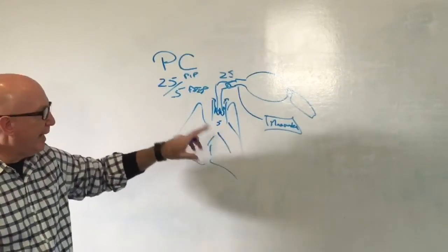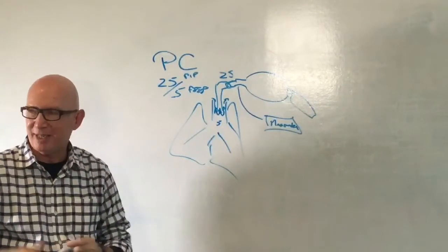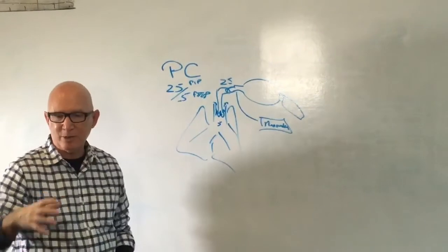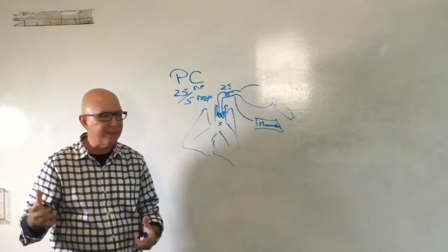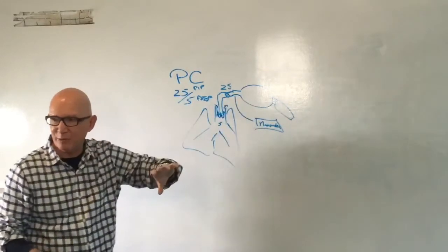And the reasoning behind that is because when we're squeezing a bag, we can make subtle changes with the strength that we squeeze the bag with that a ventilator can't do. And those subtle changes will help to stabilize this pressure and get the chest to actually rise. So there is a difference in that regard when it comes to whether it's the ventilator or the bag that's actually generating those pressures.